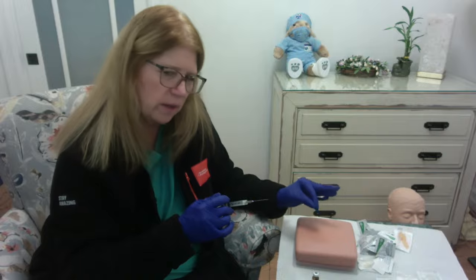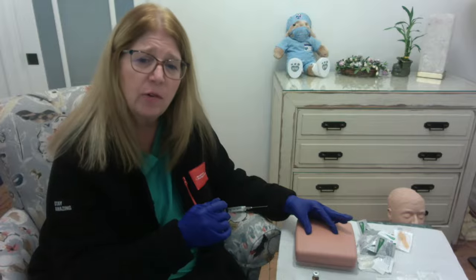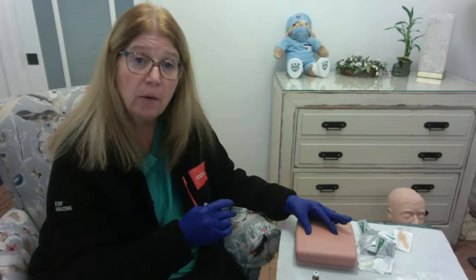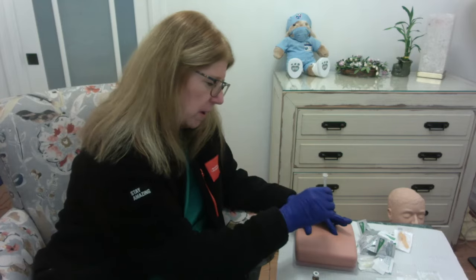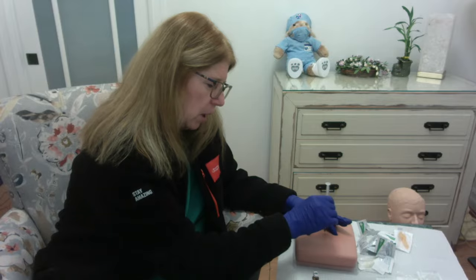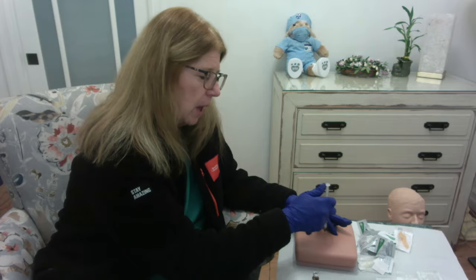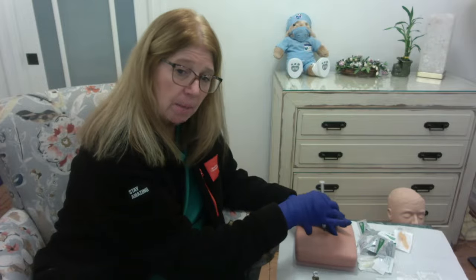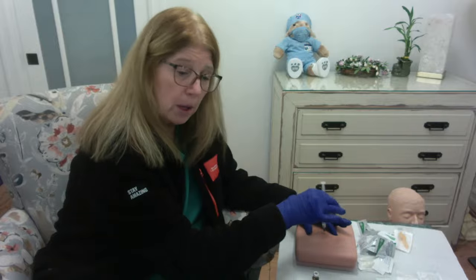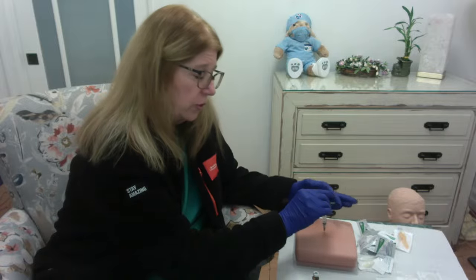Now, instead of pinching the skin, I'm going to spread the skin. So I'm going to spread, think of it as moving the subcutaneous tissue out of the way. Always 90 degrees. Again, the wrist, all right? 1, 2, 3. In we go. First step, because this is not an immunization, I have to aspirate. I'm going to pull back maybe 1 or 2 small lines on my plunger. I'm going to look to see if I get any blood in my syringe. If there is no blood, I can go ahead and inject. Again, I release the skin.